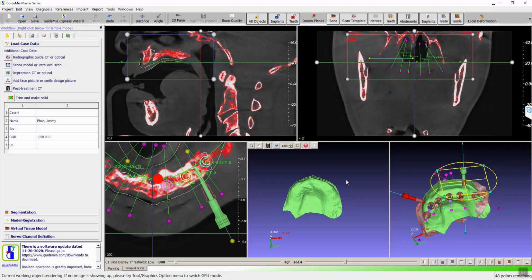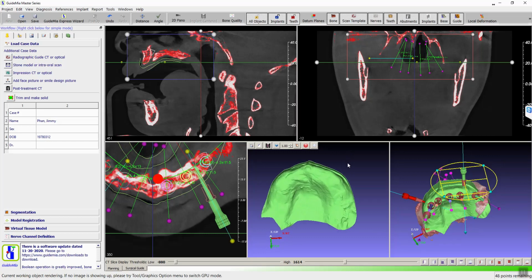That's pretty sweet. Wow. Now, did you guys notice that his hands never left his wrists? Mm-hmm.